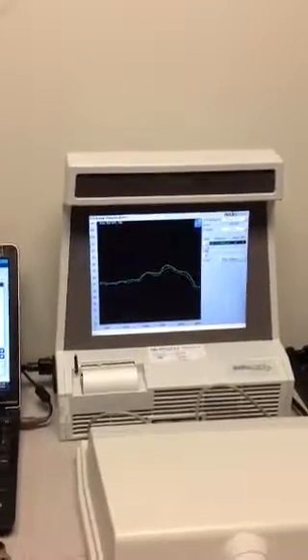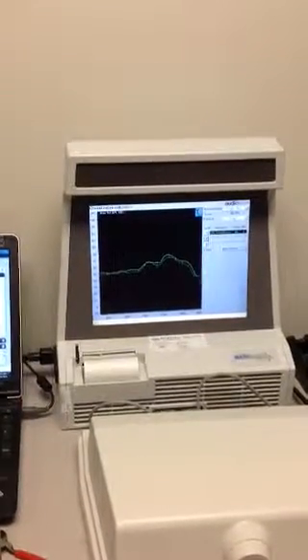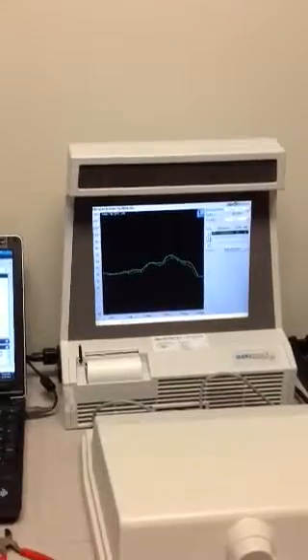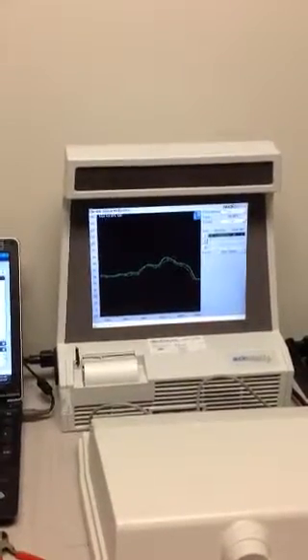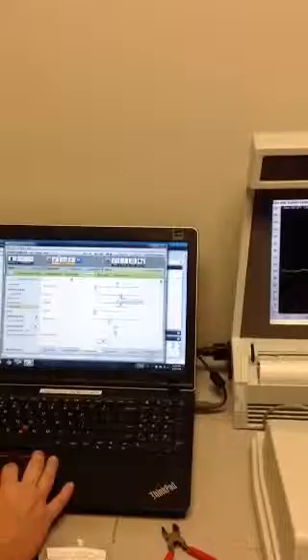So the way Phonak has theirs set up, it's defaulting to weak. But it won't let me go any higher until I force it to go into a different setting. I have to choose comfort and noise so that my microphone strategy stays omni and it allows me more adjustment of the noise settings. So now we're going to put it at moderate and see what this looks like.